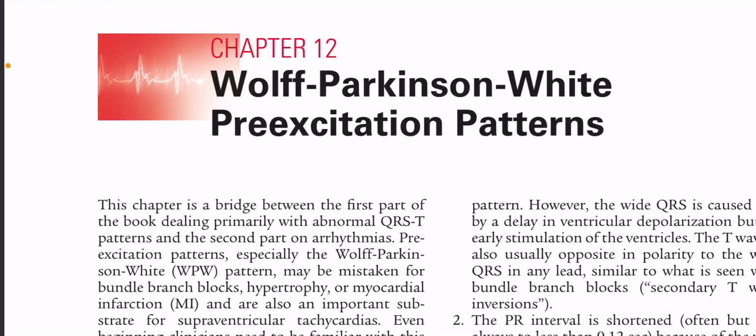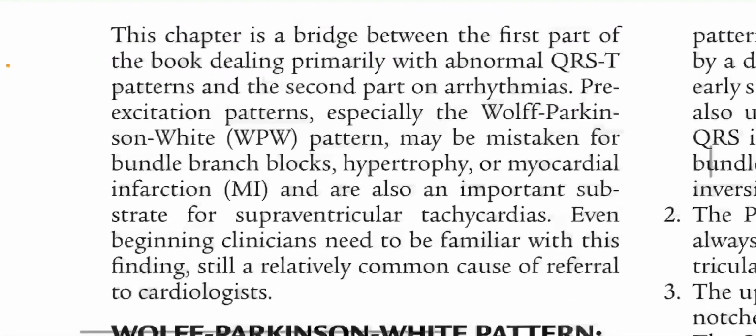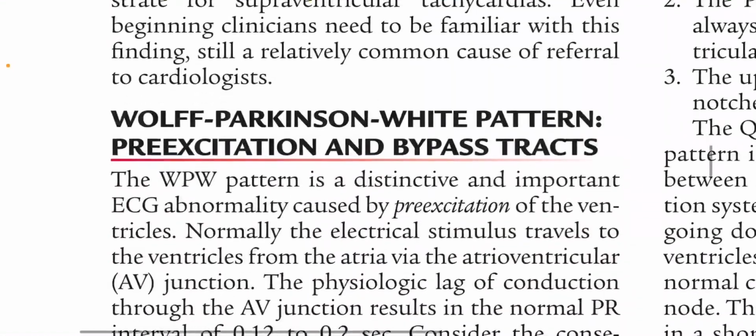Wolff-Parkinson-White pre-excitation patterns. This chapter is a bridge between the first part of the book dealing primarily with abnormal QRST patterns and the second part of arrhythmias. Pre-excitation patterns, especially the Wolff-Parkinson-White pattern, WPW pattern, may be mistaken for bundle branch blocks, hypertrophy, or myocardial infarction, and are also an important substrate for supraventricular tachycardias. Even beginning clinicians need to be familiar with this finding, still a relatively common cause of referral to cardiologist.